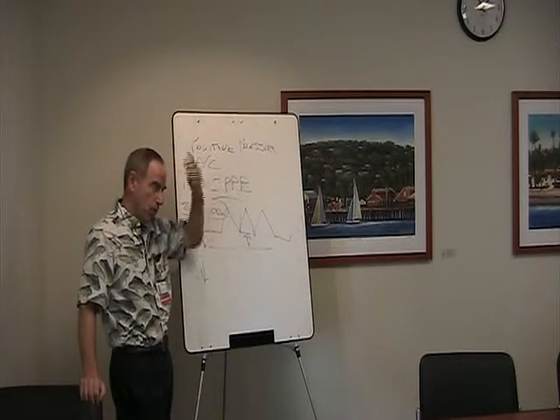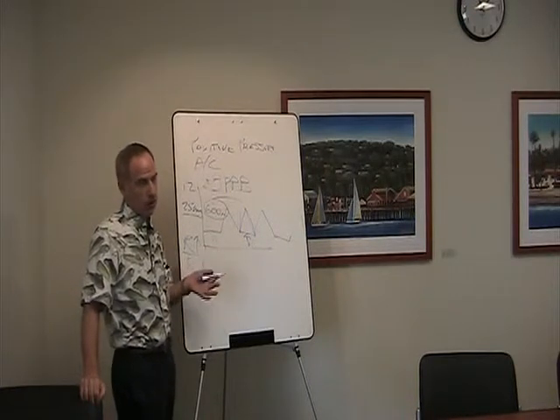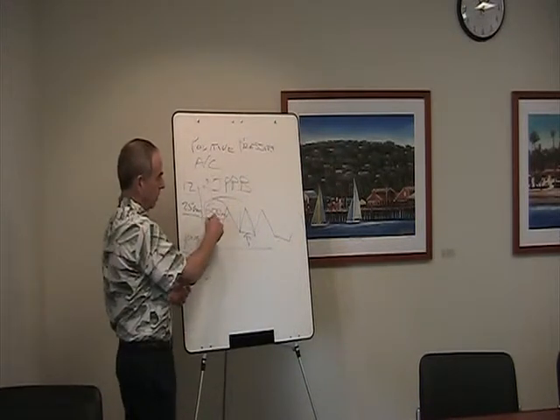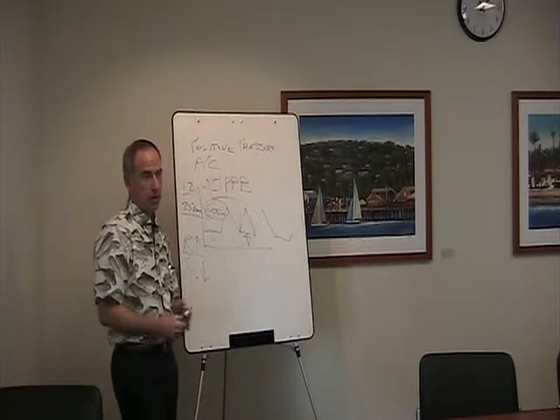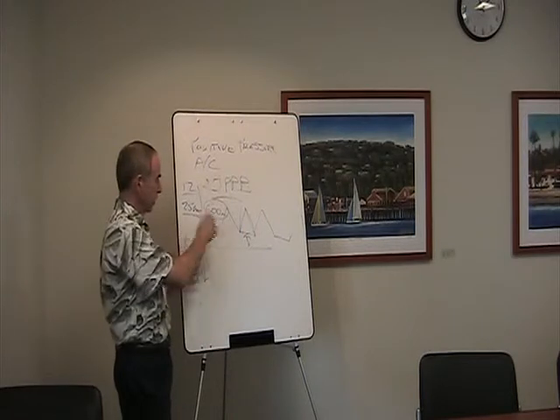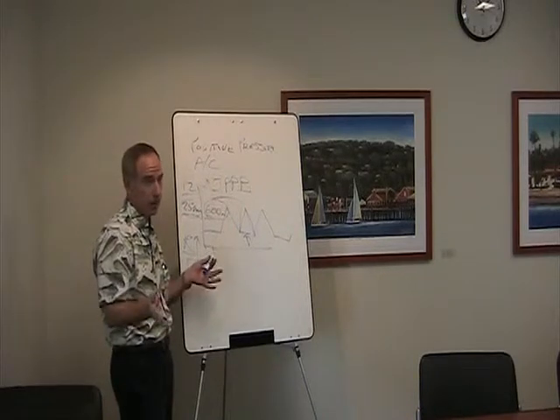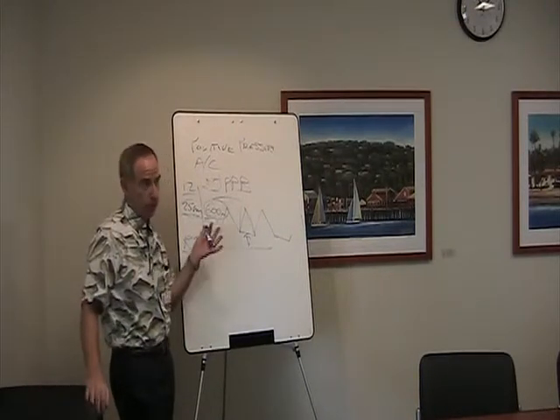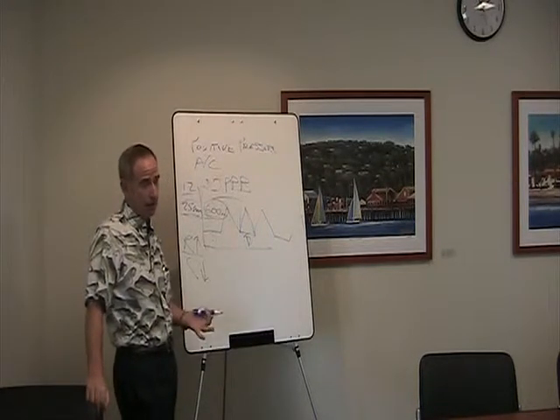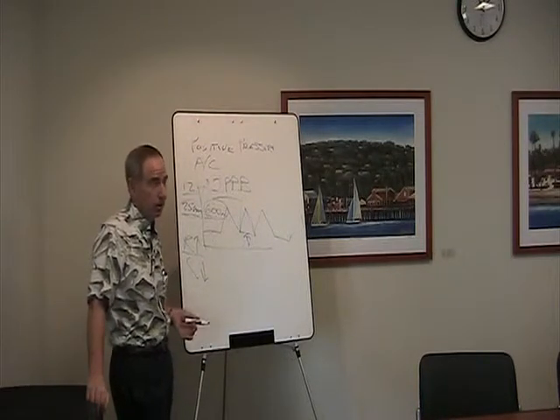But if a patient came in through the emergency room with an aspiration pneumonia or some other kind of pneumonia, what would happen? The patient would come in, I tell the therapist I want this volume, this rate, this FiO2, and they would set them up so that, say, 25 centimeters created this amount of volume. They'd set them up and leave them. And they'd get busy and go off and do other things because there were lots of patients there. So what would happen to these patients? What happens to a patient usually after you first get them with bad pneumonia on a ventilator?